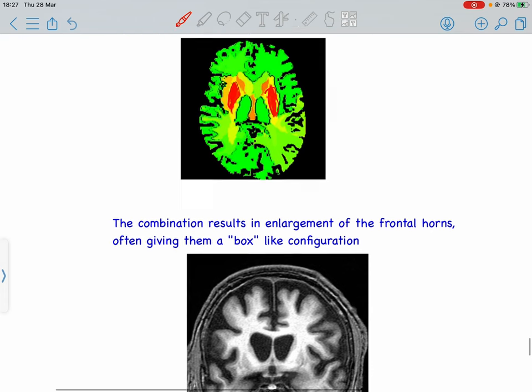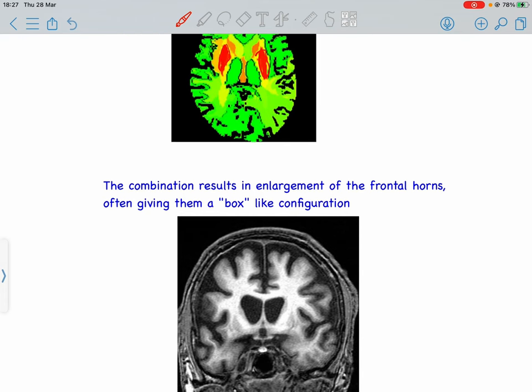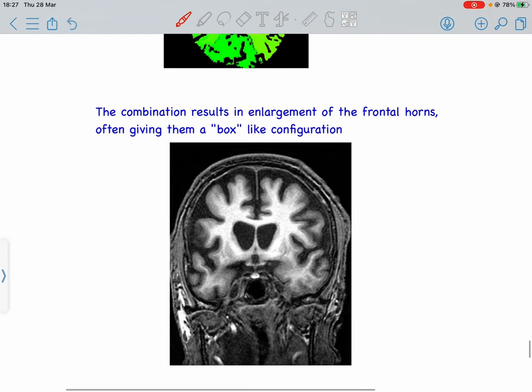These both findings—the caudate nucleus atrophy and the putaminal volume loss—lead to enlargement of the frontal horns, giving them a box-like configuration. We can see it basically has a box-like appearance.